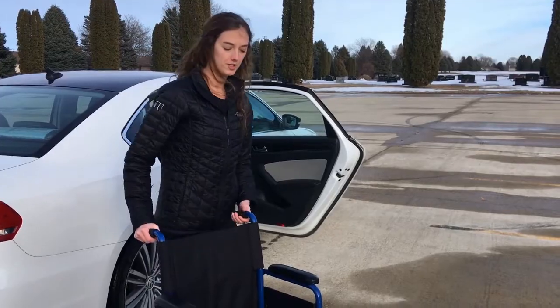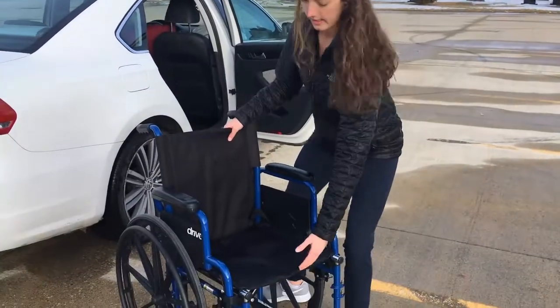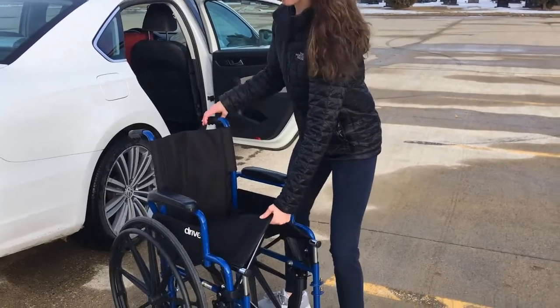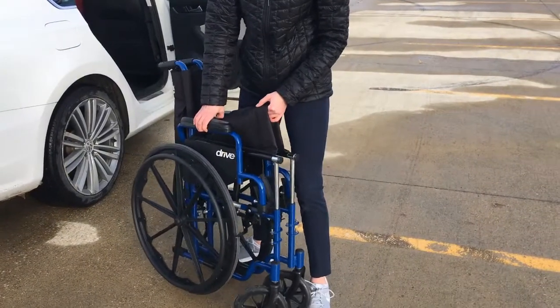Next we're going to fold the wheelchair up. Make sure you don't bend over — make sure to bend with your knees. Pull up on this cushion here and it will fold into the middle.